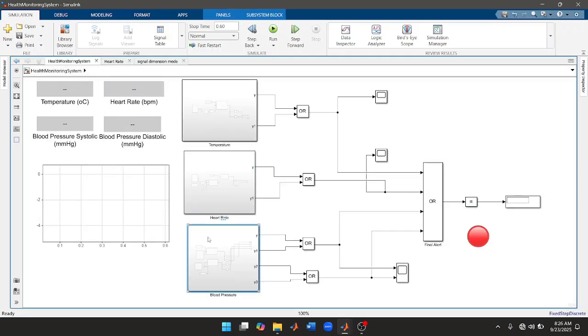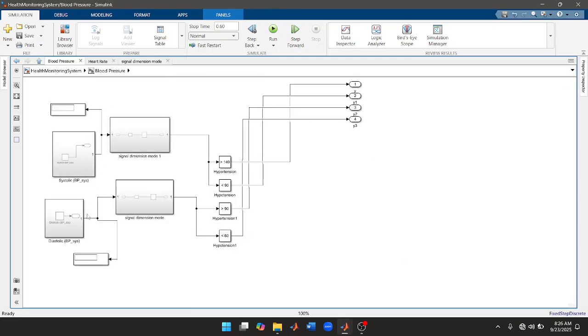Now, for the blood pressure, the systolic and the diastolic. The systolic is between 90 and 140. The diastolic is between 60 and 90. So if the blood pressure goes above 140 for the systolic, there's going to be a red alert. Below 90, there's also going to be a red alert. In between, we have normal. Also for the diastolic, above 90 there's a red alert, below 60 there's a red alert, and in between is normal.